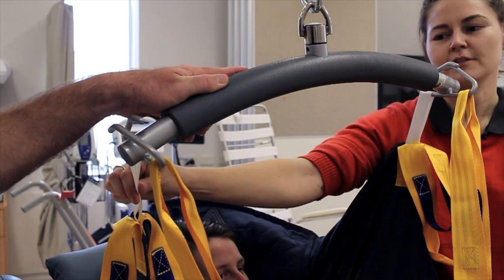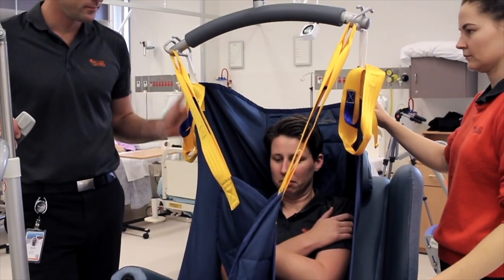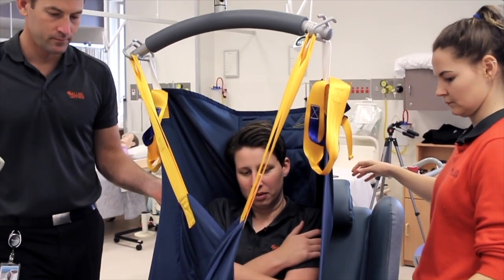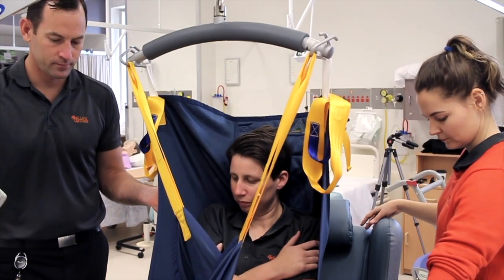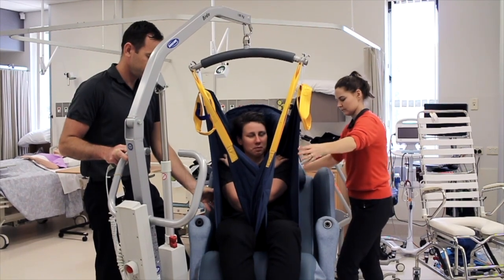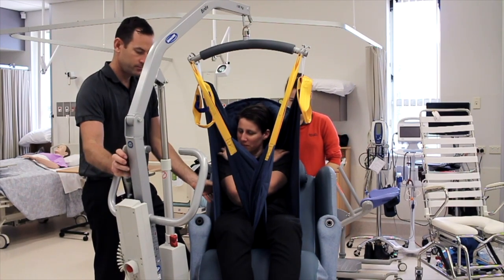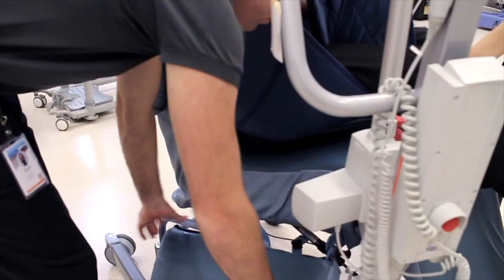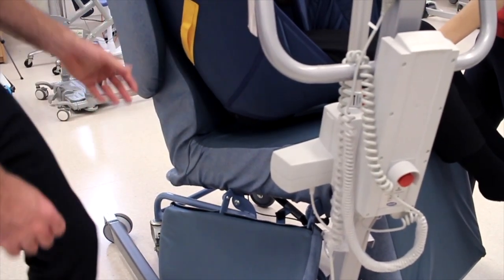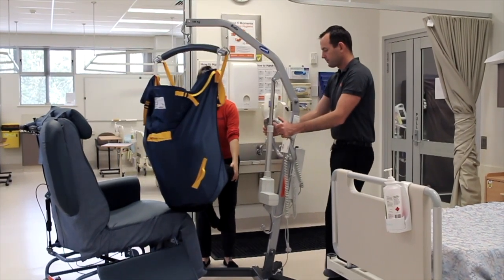We continue to raise the boom, encouraging the client to cross their arms over their chest and not hold on to any of the straps. The boom is raised until we clear the origin — being the chair in this instance — noting that the brakes are off the hoist the whole time the boom is being raised. The resident should come up into a sitting or semi-reclined position. In order to remove the chair we may manipulate the equipment to remove any upper trunk wings or armrests to get clear and easy access to manoeuvre the hoist out of the road.